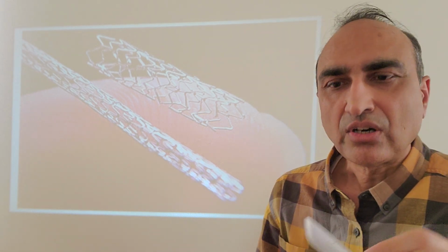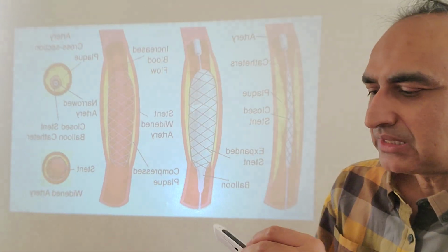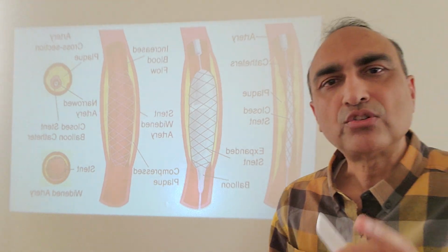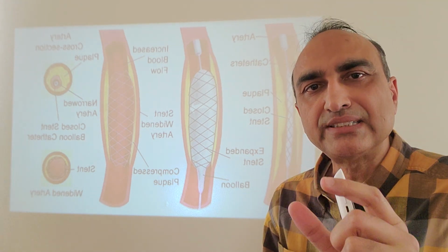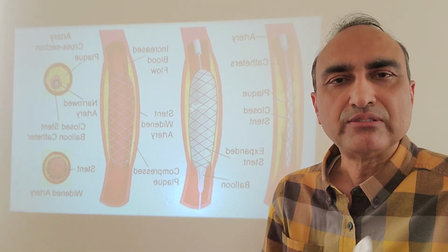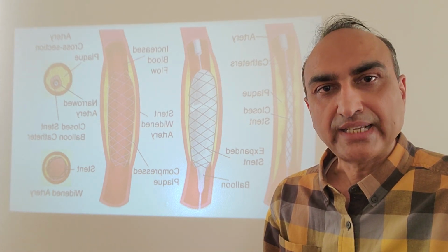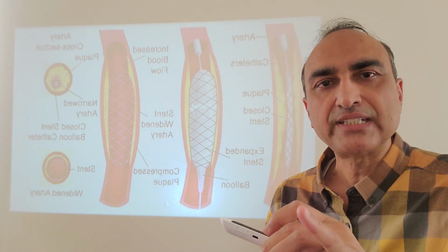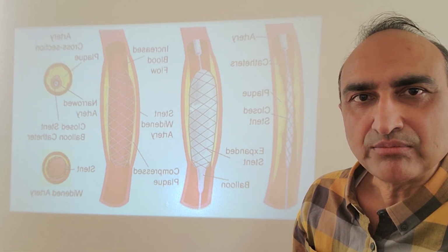In other words, all the rough material, which we're going to see in a second, is pushed and deposited on the wall of the vessel itself. It's a blessing that the coronary vessels, like other vessels in the body, are stretchable, because imagine if they were not: we would end up cracking the wall of the vessel, which is a very dangerous situation and leads to immediate death in most cases. Once you rupture the vessel and there is a leak, unless you are able to patch it up, which we have ways to do and can talk about some other time, that is certainly a very grave complication.